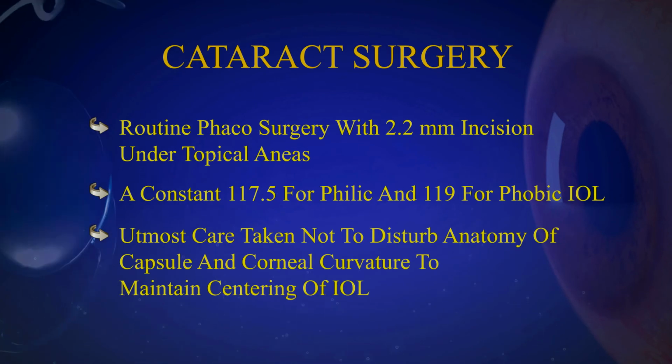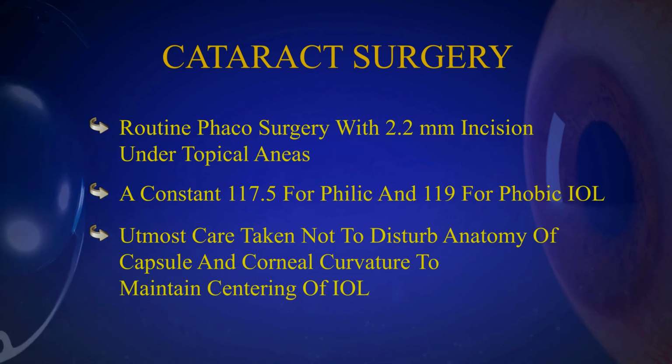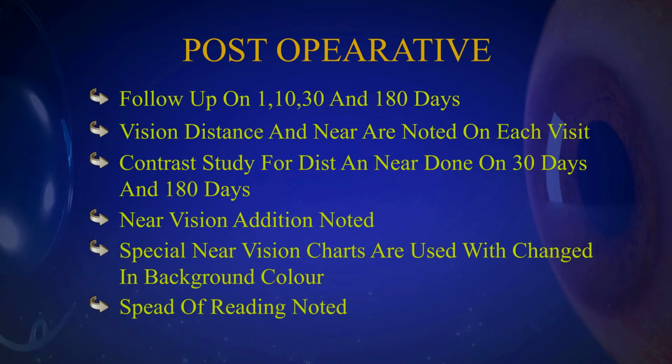The cataract surgery and the post-operative follow-up is routine like other surgery. The only difference is the contrast for near and distance are done at 30 days and 180 days. Near vision add is noted. Speed of reading is also noted for actual performance of IOL for near vision.